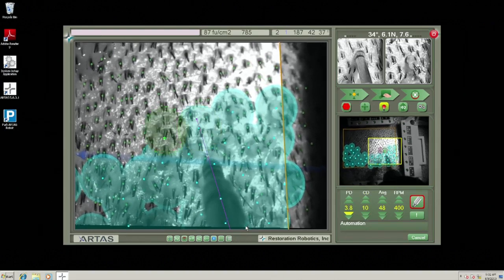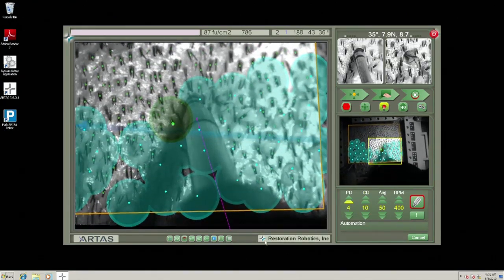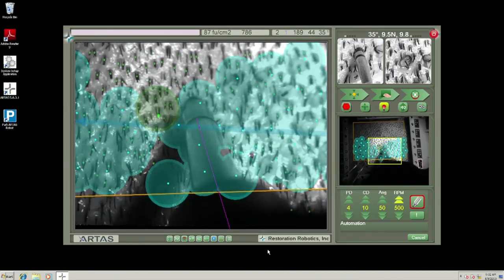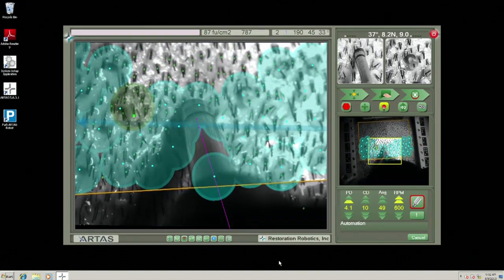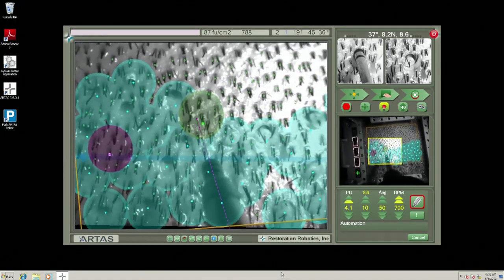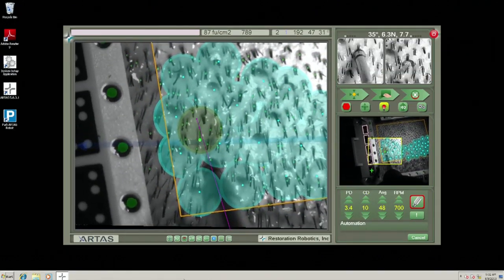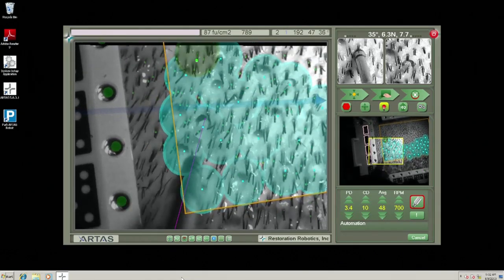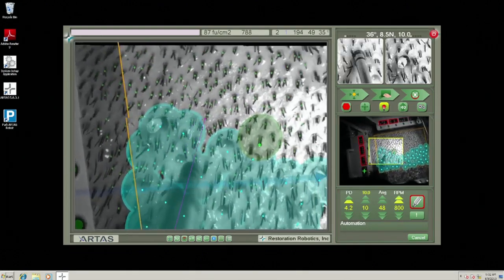But in my practice, the way that we've used it now, I'm still as fast, or in some instances probably faster, using my hands with the robot. But I can tell you that on Thursday or Friday, when I was doing motorized FUE, it's a very difficult beast, because you're a lot more fatigued by the end of the week. And so I know that I'm not as precise as I am first thing Monday morning.